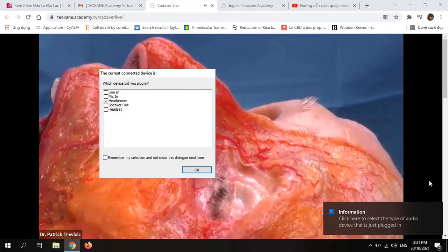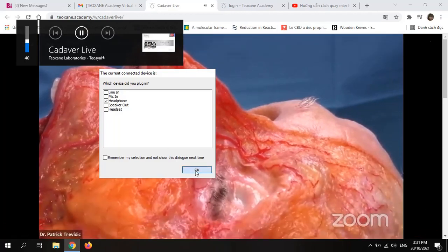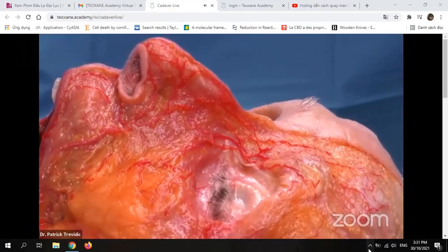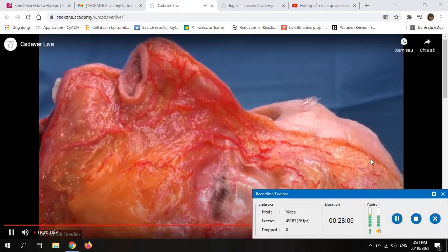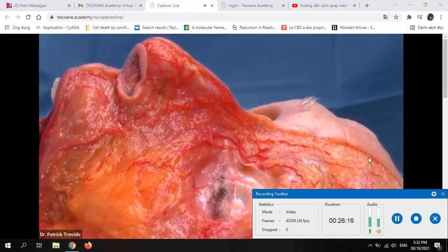And now I will let Nabila start with the mid-face and the peri-orbital area, and we will follow her after, showing where is the product that Nabila injected to her patients. Nabila, it's up to you.